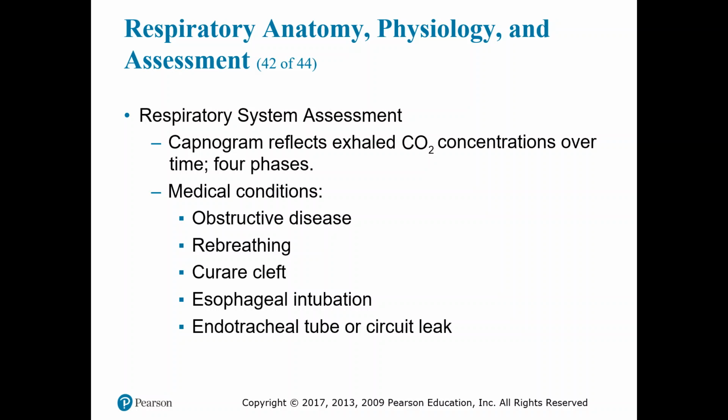An apnea waveform will be if it falls to baseline. If there's no movement, there's no waveform at all, they're apneic, and you need to start bagging the patient.